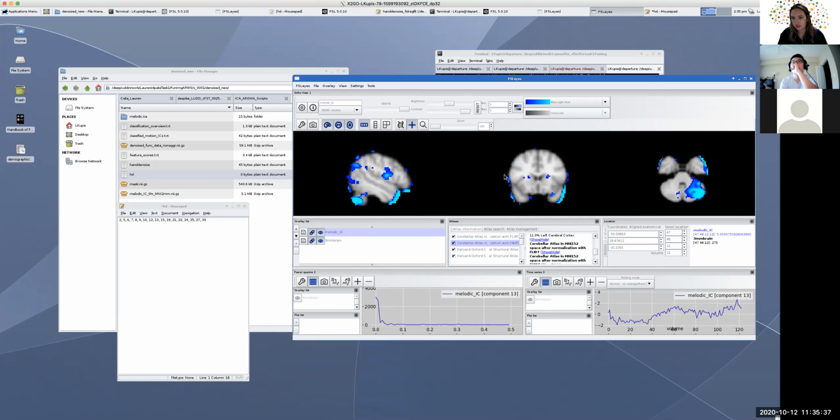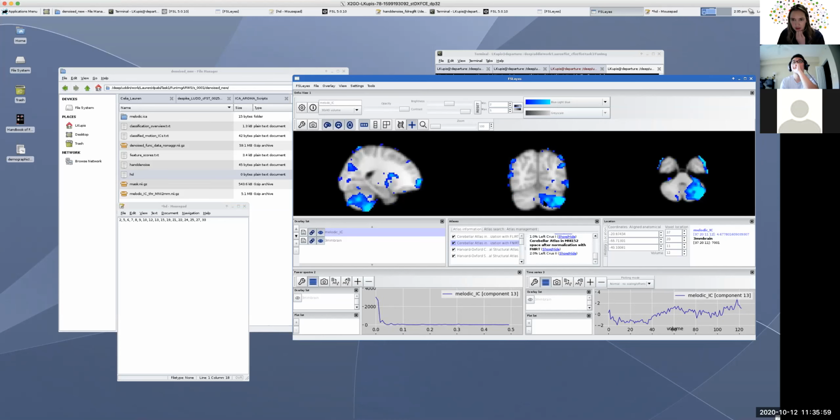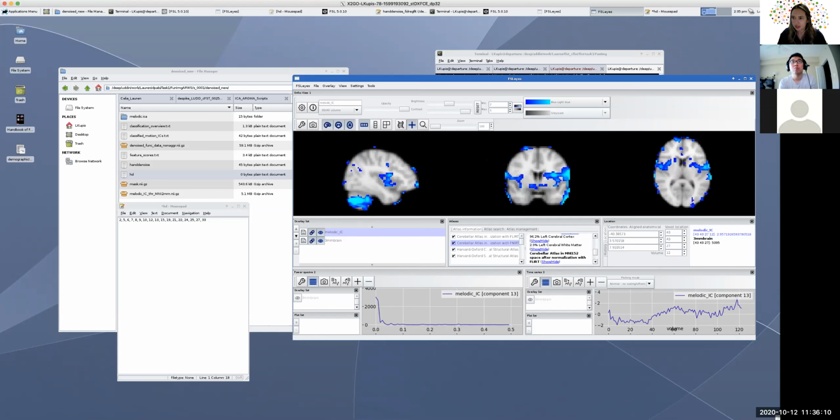Yeah, so there's also some of the ringing around the brain. So I would go ahead and just put that as noise, even though the power spectrum doesn't show anything. And then this time series is a little bit rough, but nothing crazy. The only thing is that it has pretty good signal in the cerebellum. So if you really care about the cerebellum, you might want to try to keep that in, if that's a region of interest for you. But because the rest of it's a lot of ringing, I would probably go ahead and put that as noise. And they already put that there for us.